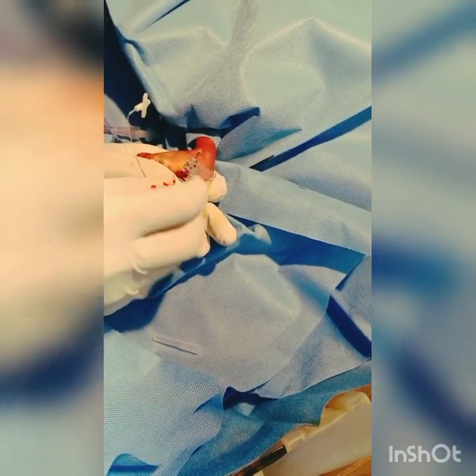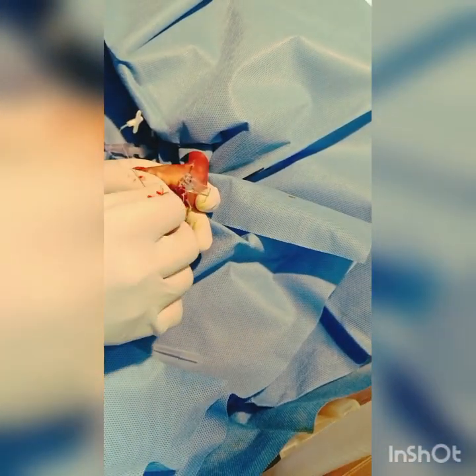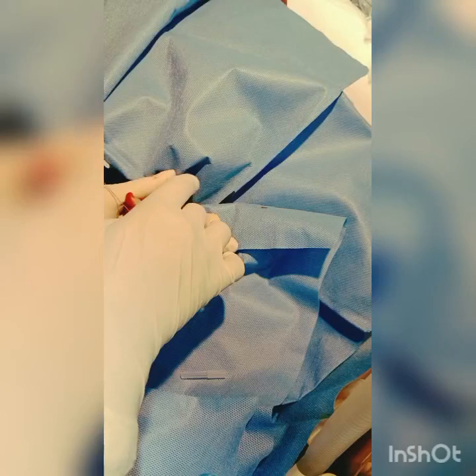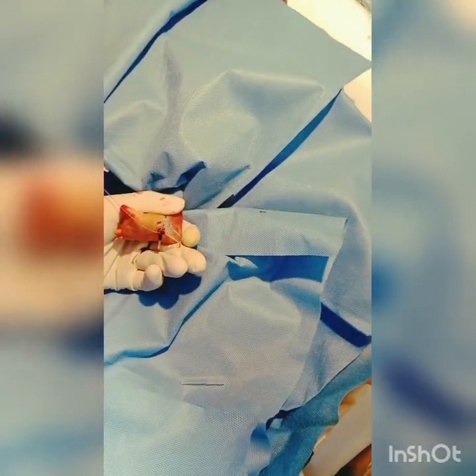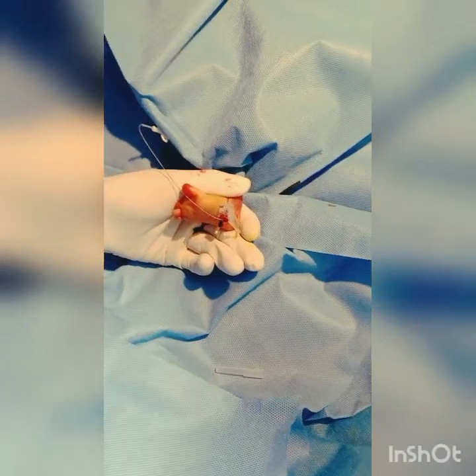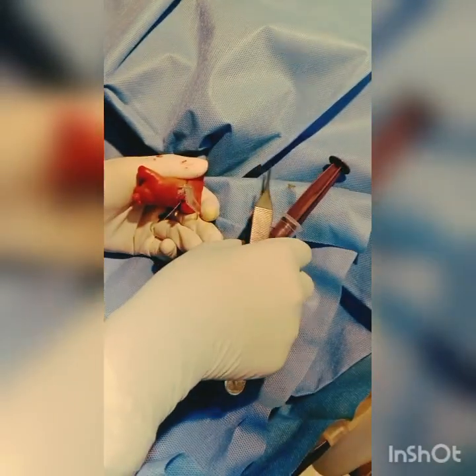Take a little bit. It's okay. Hemostasis also needs to be monitored — hemostasis throughout the procedure.